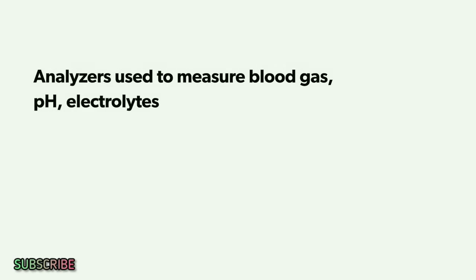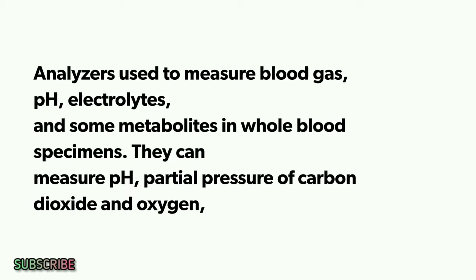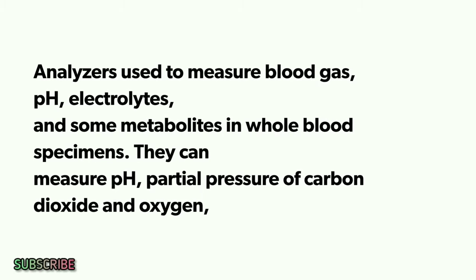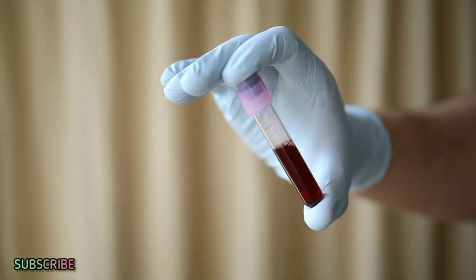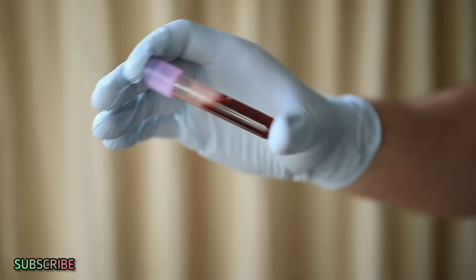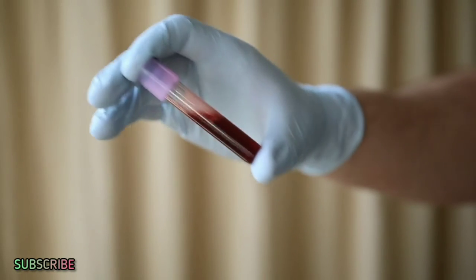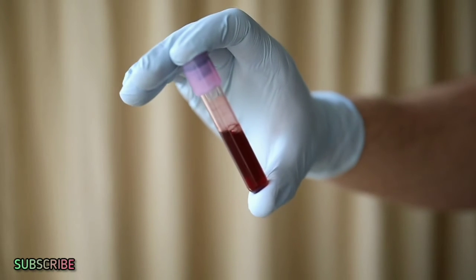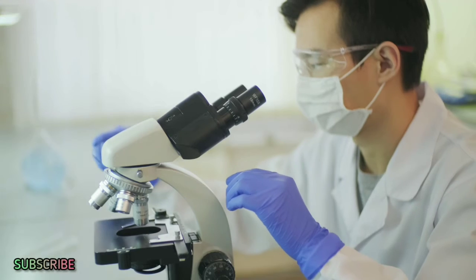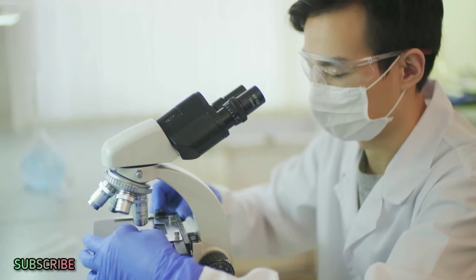Analyzers are used to measure blood gas, pH, electrolytes, and some metabolites in whole blood specimens. They can measure pH, partial pressure of carbon dioxide and oxygen, and the concentration of many ions like sodium, potassium, chloride, bicarbonate, and metabolites like calcium, magnesium, glucose, and lactate. They are also used to determine abnormal metabolite and/or electrolyte levels in blood and the patient's acid-base balance, and the levels of oxygen and carbon dioxide exchange too.